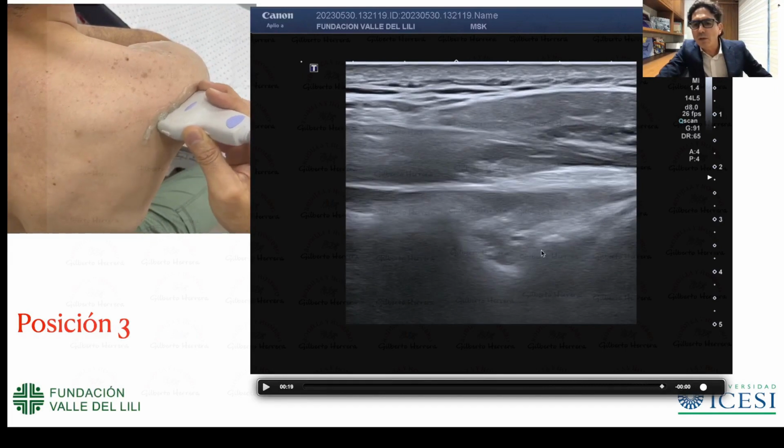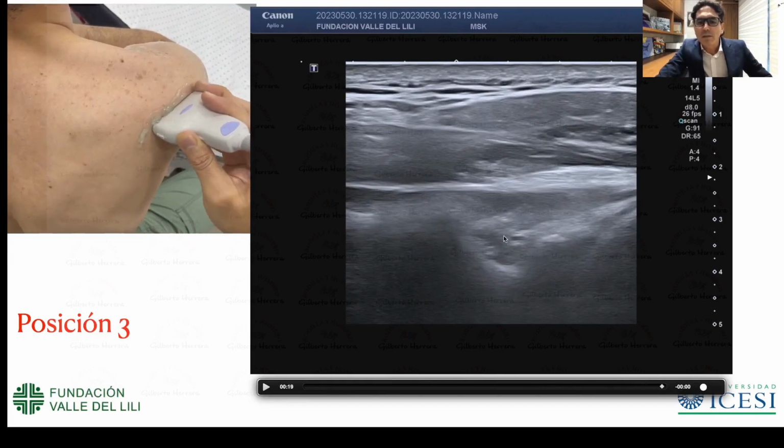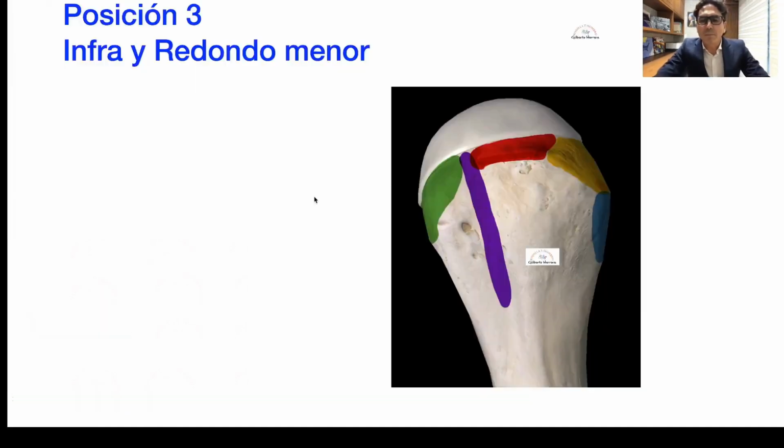The first thing we would identify is our glenoid, sound reading. So now we know that here in the spinoglenoid fossa, there is a honeycomb. We already know how to read it, a honeycomb or a mulberry, whatever you want to call it. That's the suprascapular nerve, the spinoglenoid ligament. And there are also structures here like blood vessels.